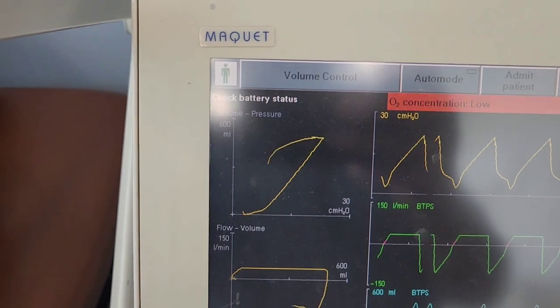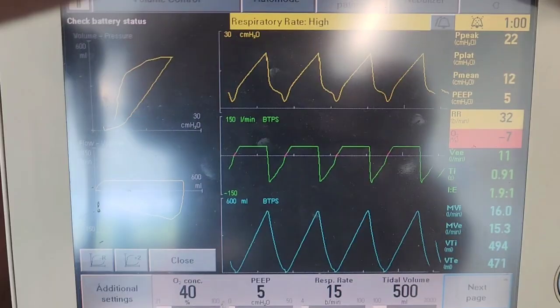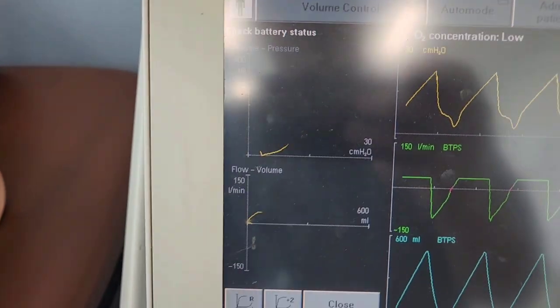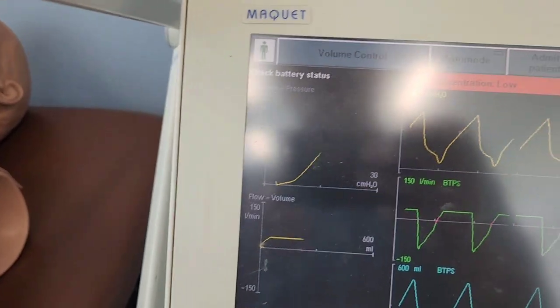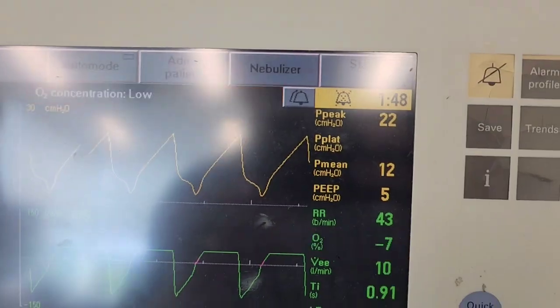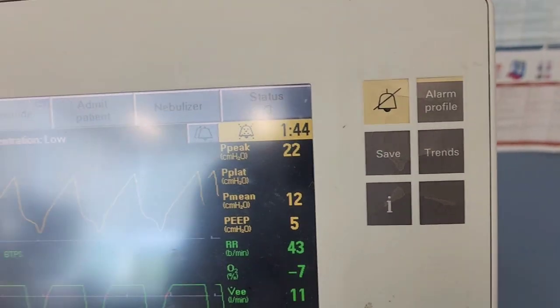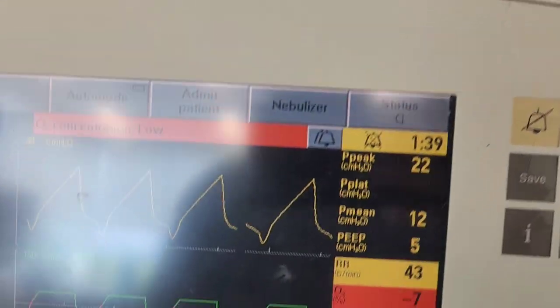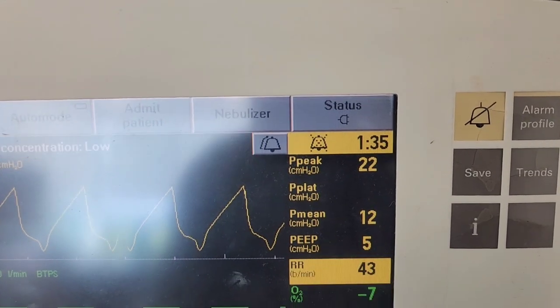Okay, so the servo actually adjusts the scale of the loop, but it has come down closer to the pressure line. Let's look at your compliance or the plateau pressures. Let me get a few things out of the way here. So now we have PIPs of 22. They were 14 before. You want to keep note of that.